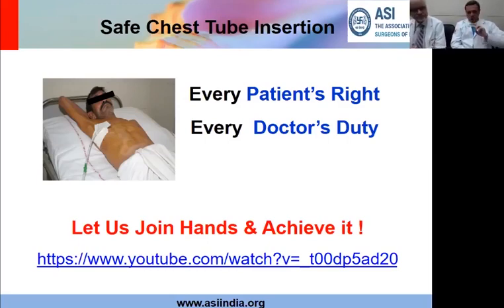Also remember, you should imagine the patient in lying down position and never have the chest tube coming out of the area that will be touching the bed when the patient lies down. Sometimes I have seen the chest tube put on the back side, and when the patient lies down, the tube actually gets kinked because the patient is sleeping on the chest tube. So that is very, very important. It should also not be too far towards the anterior fold. It should be in such a way that when the patient is lying down, the chest tube is draining without any kinks. I think it clearly states what should be done in this situation.